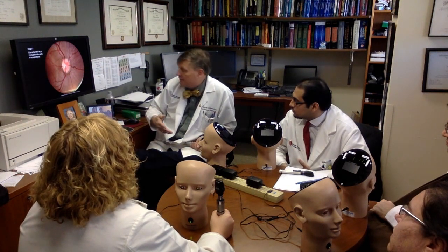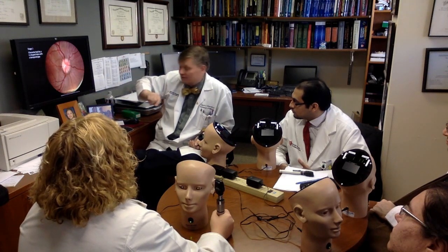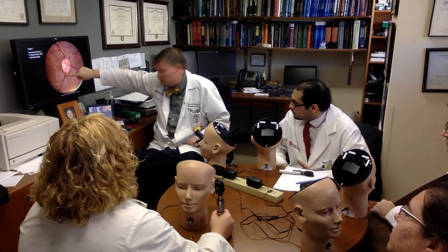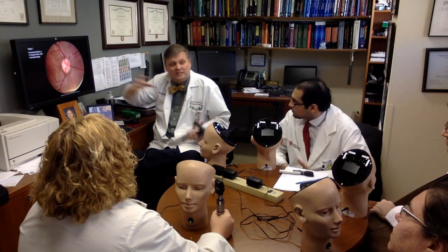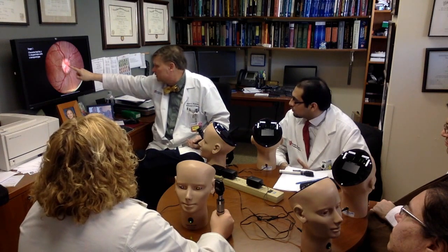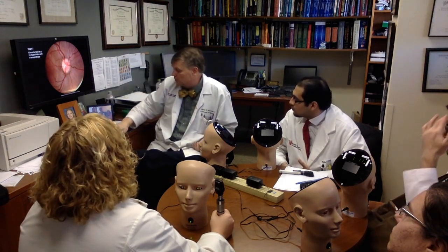However, this is a little bit beyond that, because the important thing here is the optic nerve head is elevated. How do you know it? Look at this vein, artery. It runs here, down the hill, out it goes. You can appreciate the optic nerve is physically elevated. Look at this one, down the hill and physically goes. That's the really important thing.